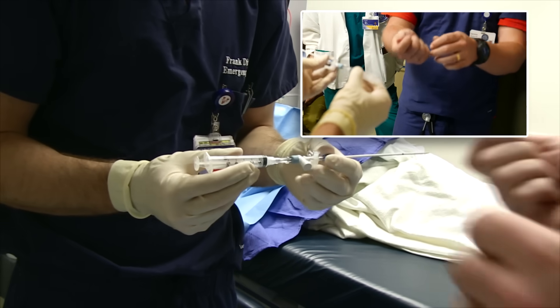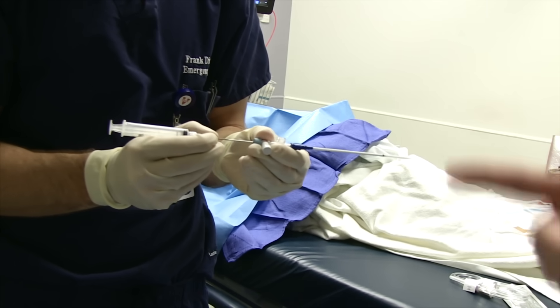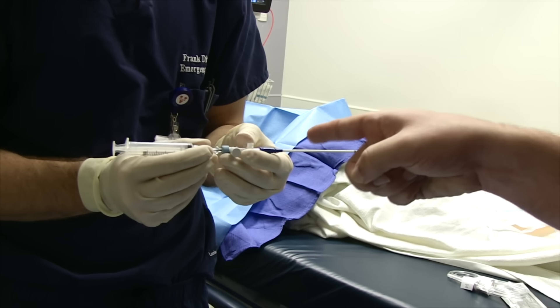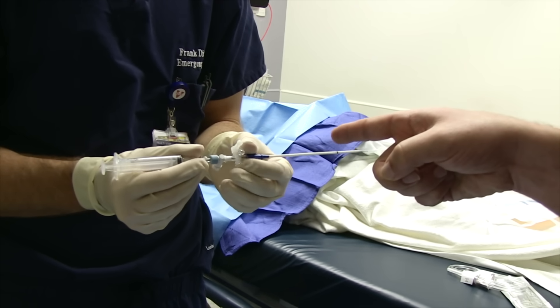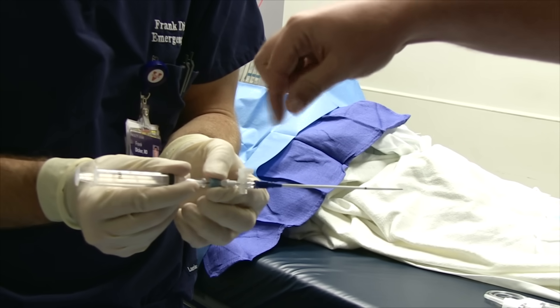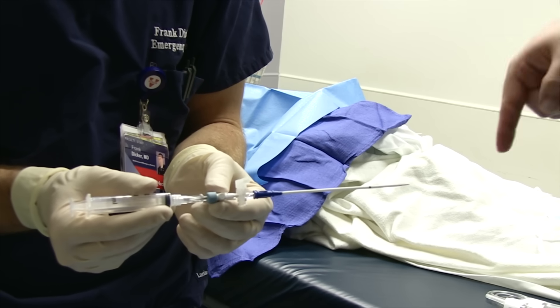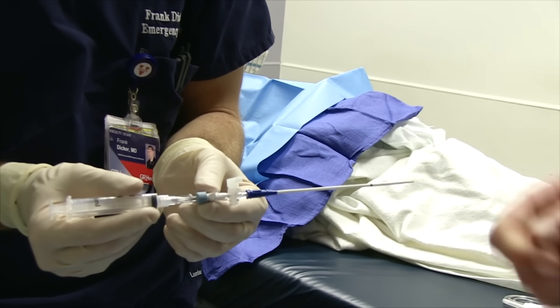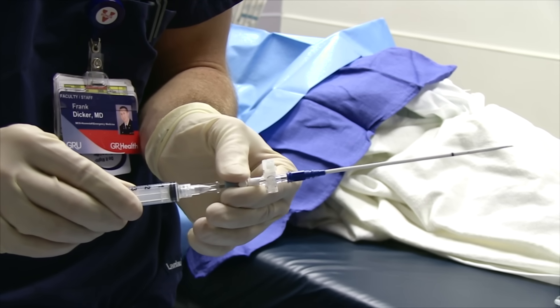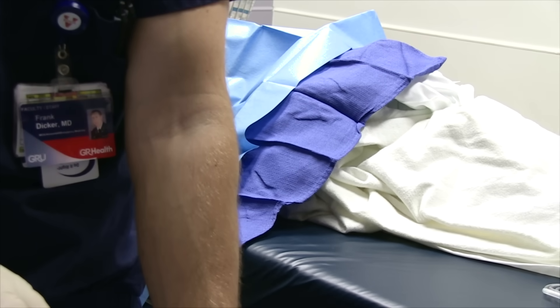Pull back on the syringe — not the whole apparatus, just the syringe. Hold it at the hub; don't pull it all the way out, because once you pull it out, you're done. A lot of people think it disconnects at the junction, but it doesn't disconnect there. It has a three-way stopcock — whatever it's pointing to is off, so pointing this way is on, and you can aspirate fluid. Make sure your Luer-lock is always set that way. Before placing the catheter, make a small skin incision with your scalpel right where you placed your local anesthesia.